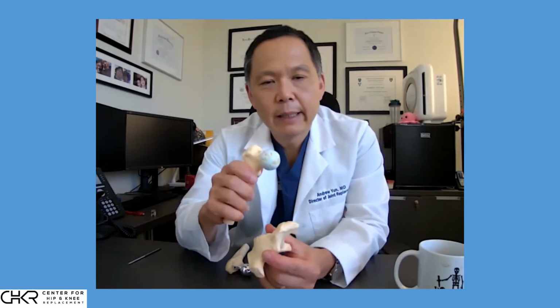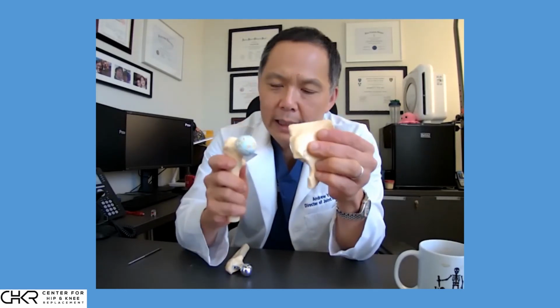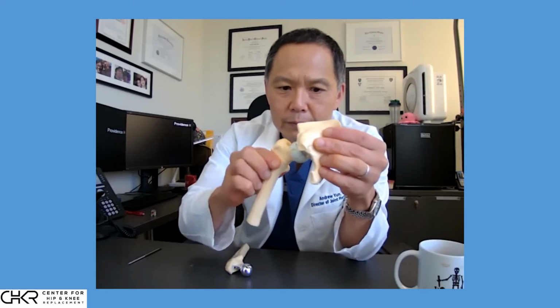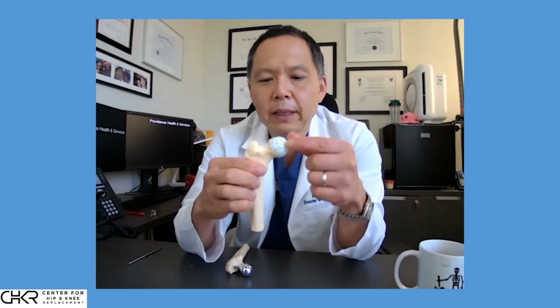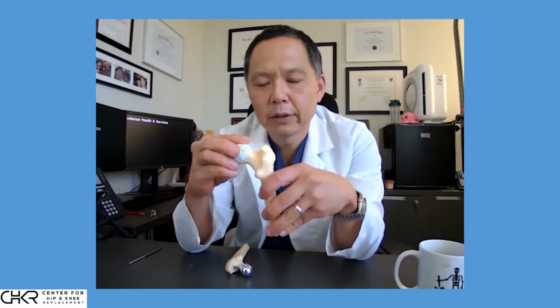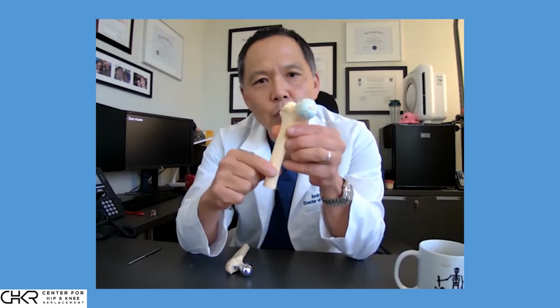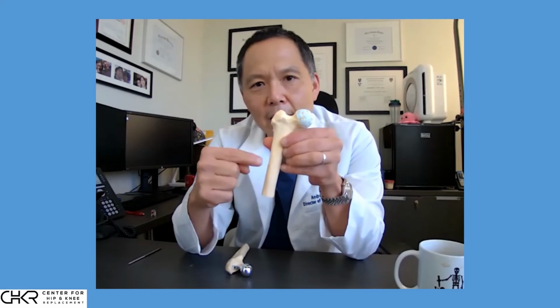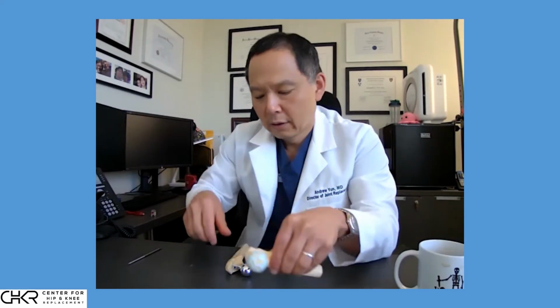Okay, let's just take a little bit of a look dynamically of how a hip replacement works and how we manage these obstacles. So for hip replacement, we have the acetabulum and we have the femur. But we're going to focus on how we manage obstacles here. So this patient, prior fracture along the femoral neck, now with an arthritic head. But we're trying to deal with that obstacle that's deep in the canal. Now, we're not going to be able to see where that obstacle is. We can only infer its position from the x-rays.